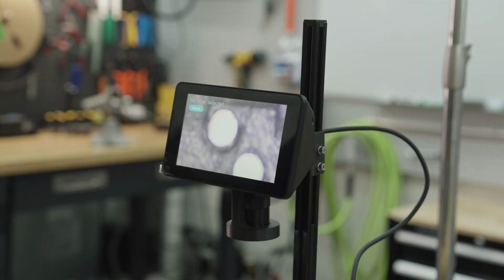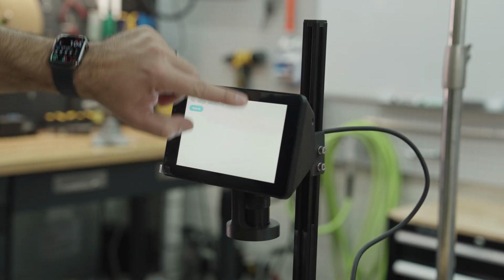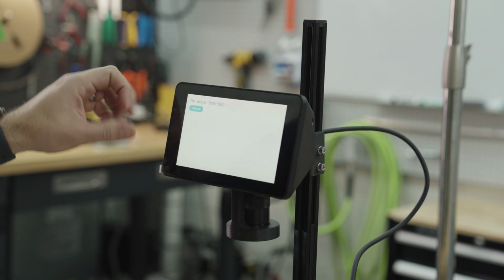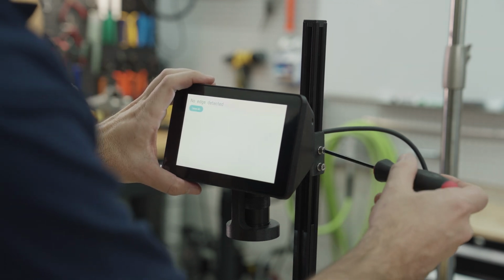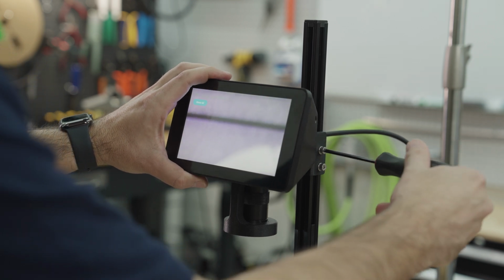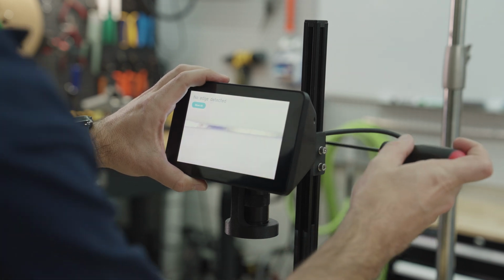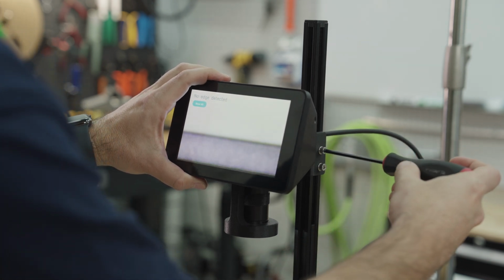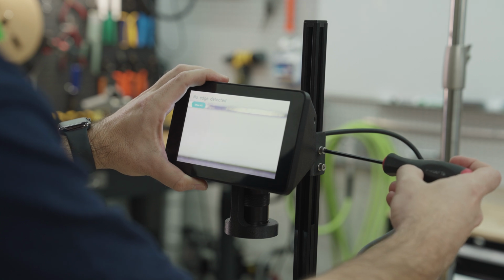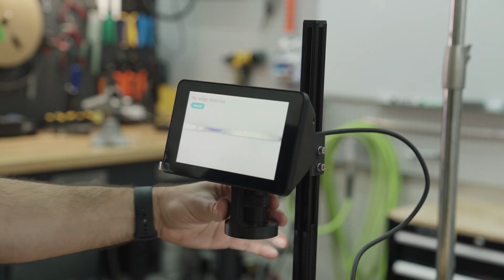Now let's adjust the microscope. First, pan all the way down, like this. Next, loosen the top screw to tilt the microscope forward. If we go too far, we'll see some of this black anodizing. The goal is only to have the white background in view. That's good there. Now let's focus our image.